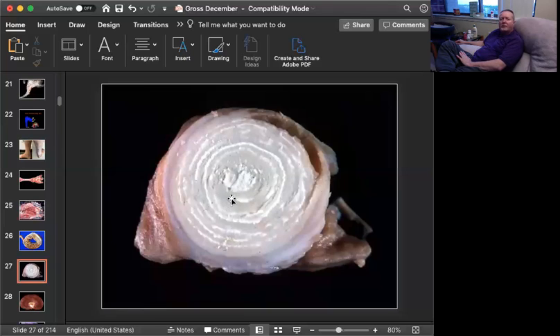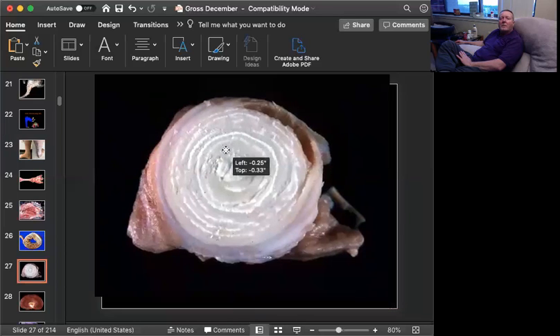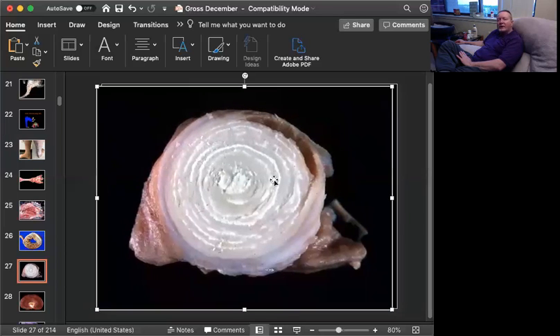So eventually it's going to rupture through that, and then you're going to have another layer of suppuration. Then it's going to get walled off, and then it's going to break through that. And we have these multiple layers of suppuration, granulation tissue, fibrous connective tissue, suppuration, just keeps breaking through until eventually it effaces the wall.